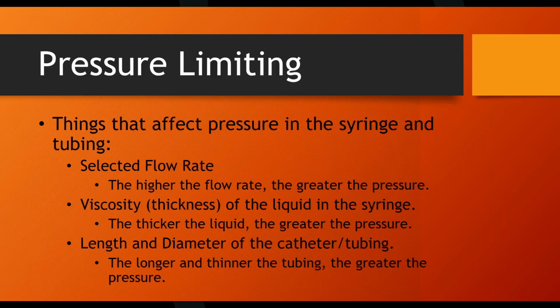To keep the fluid in the syringe warm while it's not in the warmer, there is a little clamp that goes over it, and it's just a little heater. It won't heat the contrast up, but it's got coils on it that warm to 37, 38 degrees Celsius, body temperature. So they'll just clamp it around the syringe, and it'll help keep the contrast and saline warm longer than if it was just sitting there. They don't use warmers nearly as much as they used to.